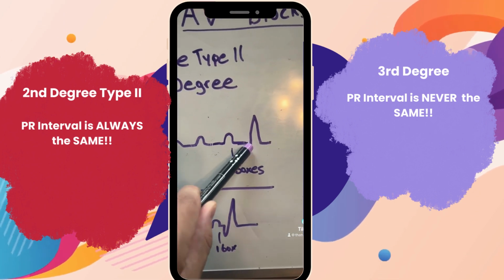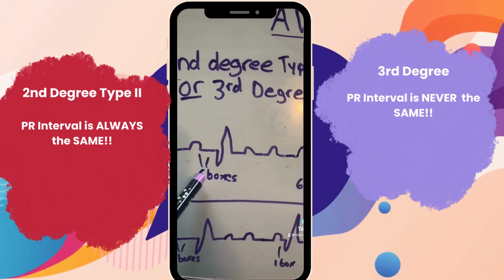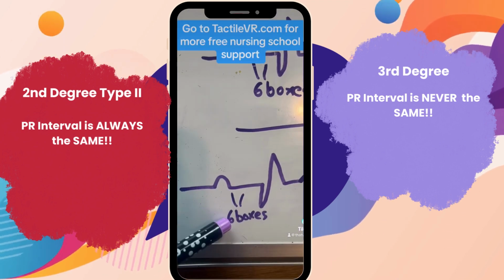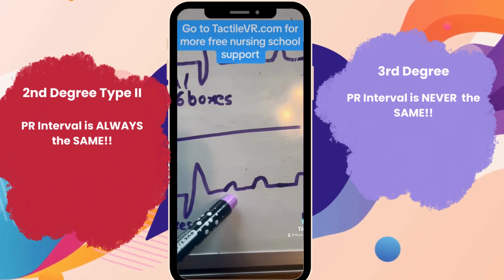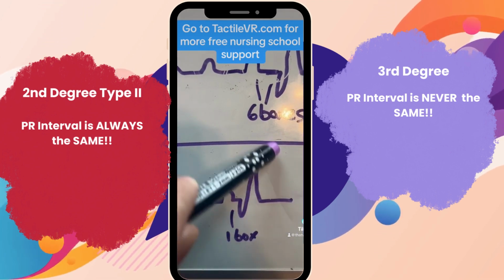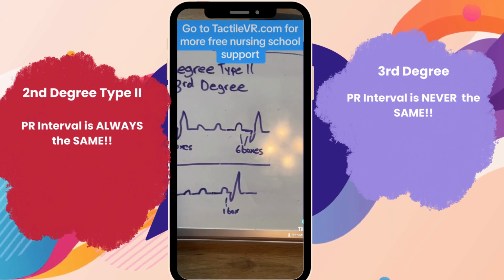There's the heart block. And then the PR interval here is also 6 boxes. Okay, so just determining the difference, we know that second degree type 2 has always the same PR interval. And then we have third degree where there's heart blocks, and then we look that the PR intervals are not the same. The first example had 6 boxes, and then the second PR interval had 1 box.